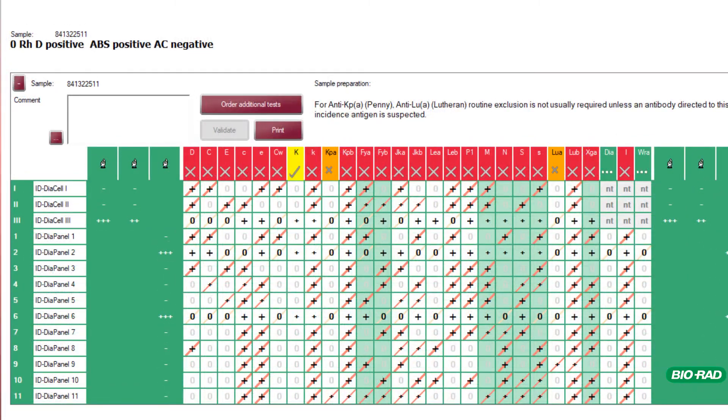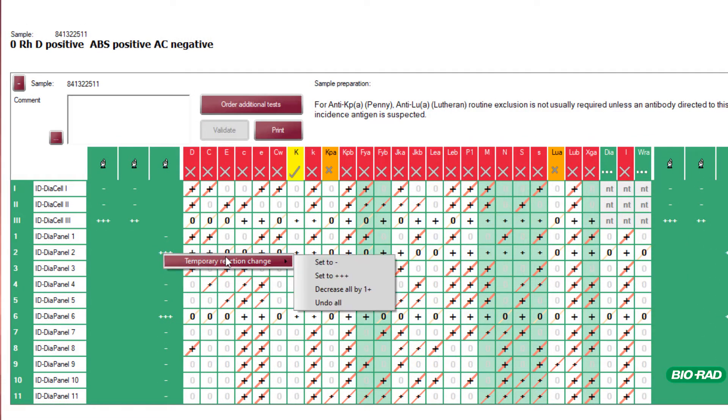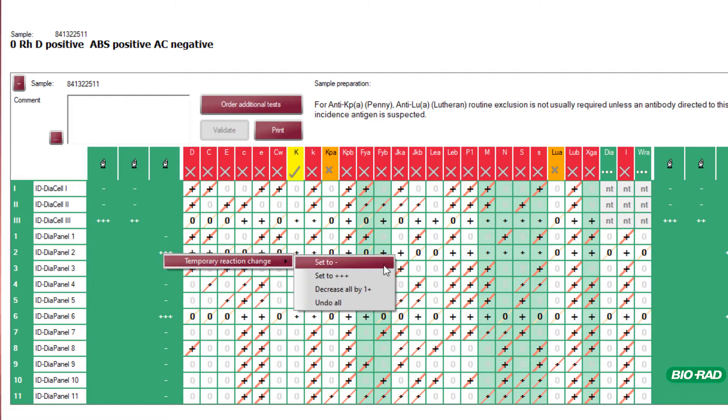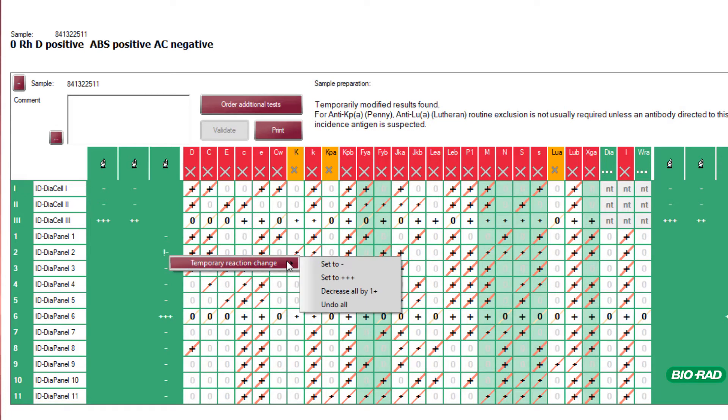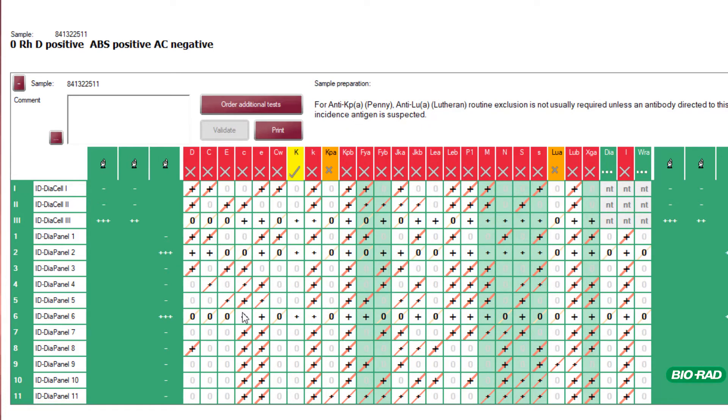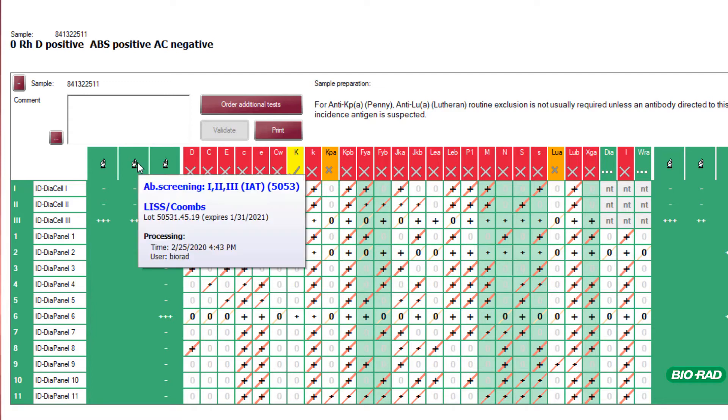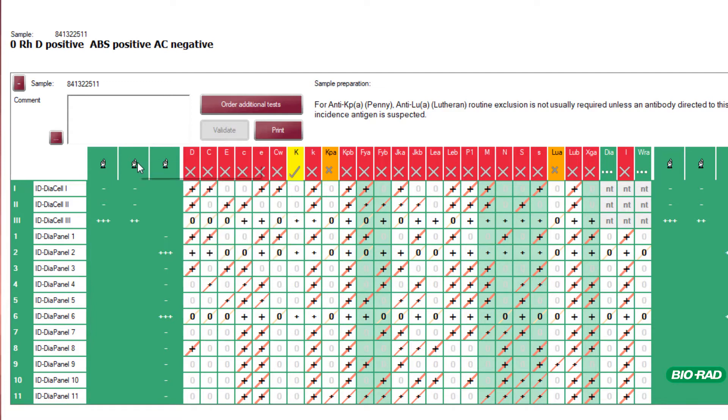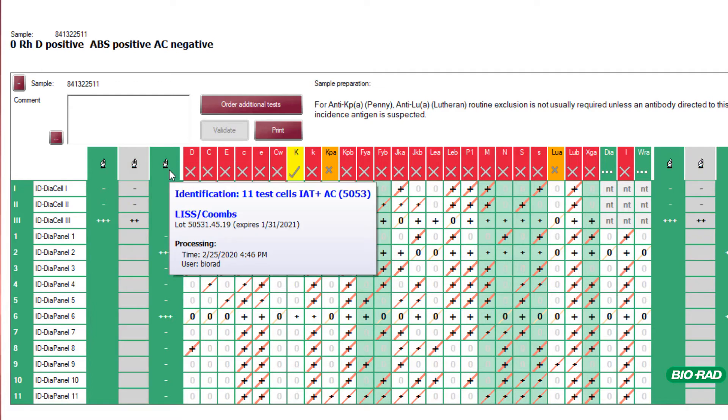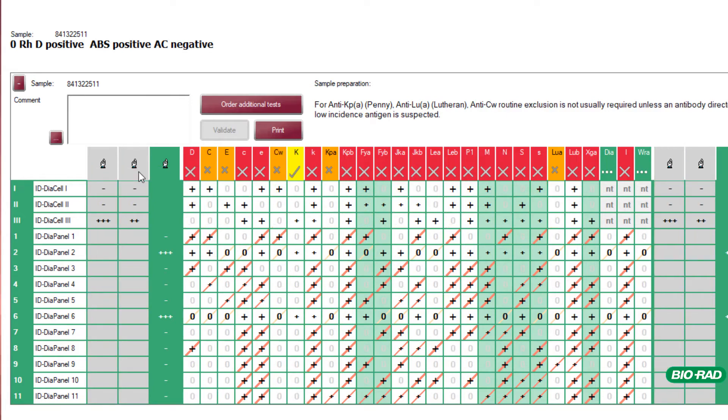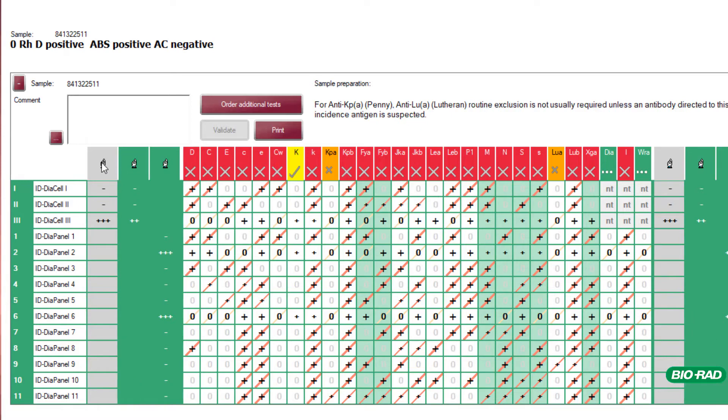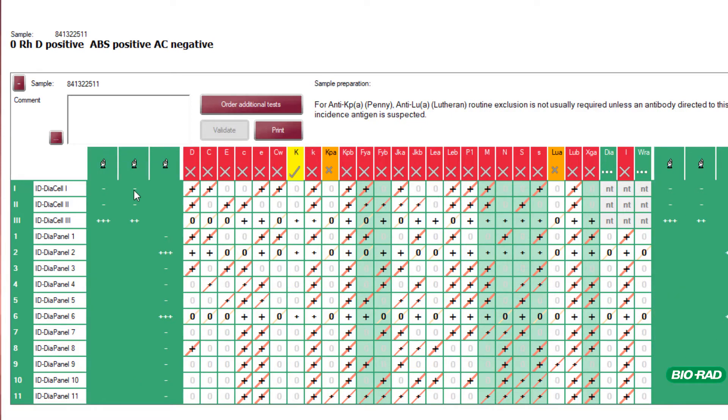The user can make temporary changes to reactions to see how this impacts the final evaluation. The user can also exclude different phases of testing and different panel types to see how this impacts the final determination. These changes are temporary and can be undone at any time.